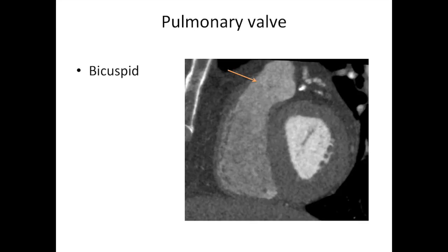The second valve as you go through the heart is the pulmonary valve, and this is the exit of the right ventricle that the blood takes. You can see it here with the orange arrow and the blue lines — you can just make out the pulmonary valve on this CT scan.